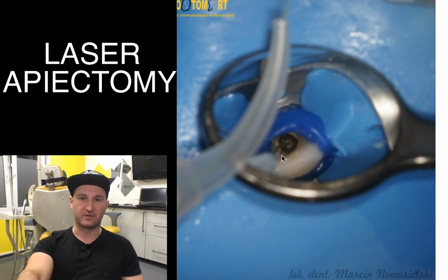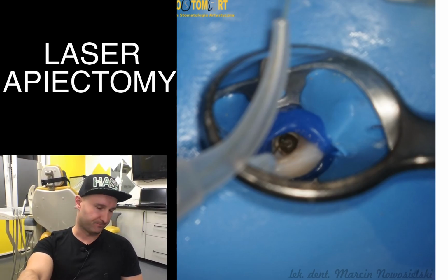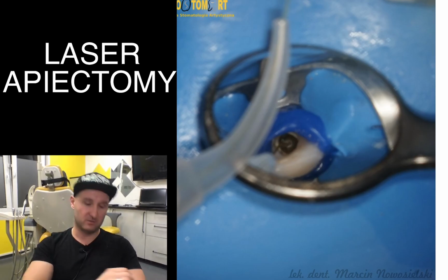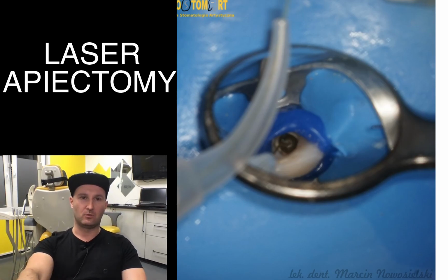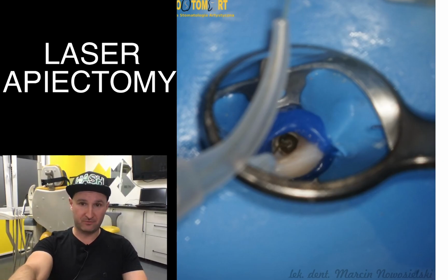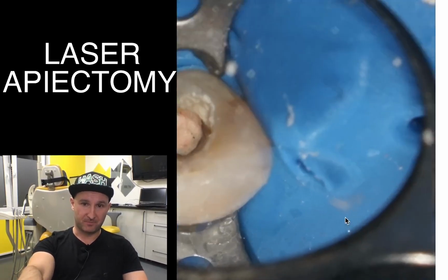So after we prepared the canal, after we irrigated it, after we dried the canal, we proceeded with disinfection of the canal with neodymium laser. It was done in 2 sessions, every session about 15 or 20 seconds. I don't remember the used parameters, but I guess it was 1.5 watt, 10 hertz, and 100 microseconds pulse duration. So after that we performed the filling of the root canal, as you can see here.